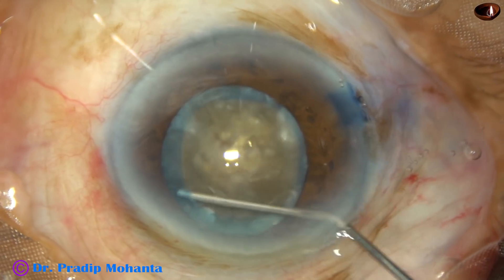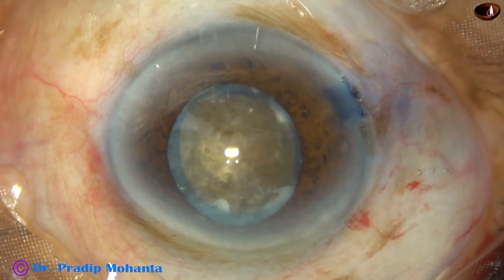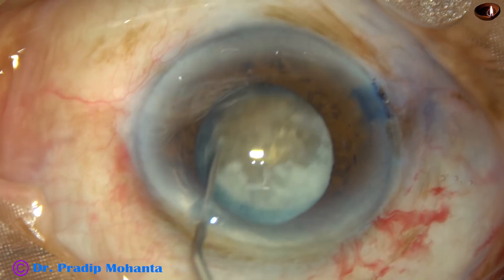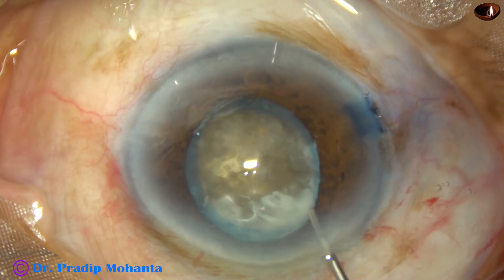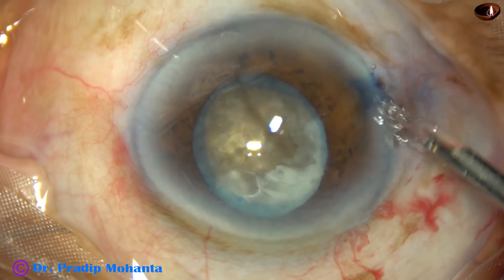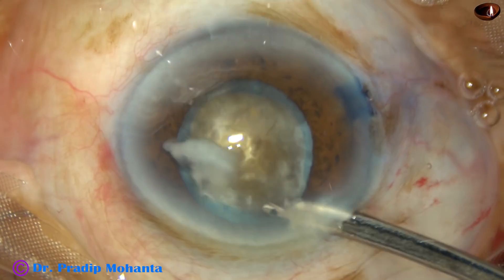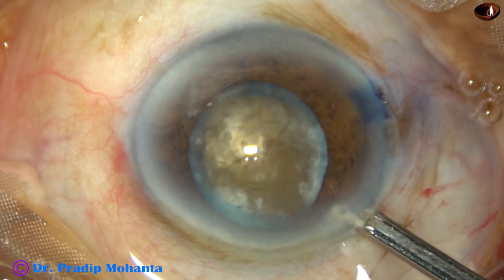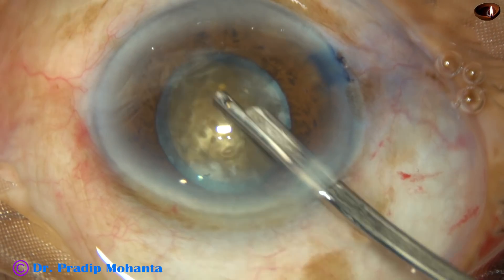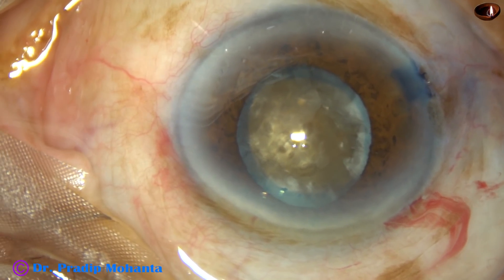I am doing hydrodissection again. Very small amounts of fluid are being injected at multiple points. The nucleus has rotated very nicely and I am very happy. As the nucleus has rotated, I can see some more white flaky material just in front of the main incision. So I am going to use the 23G Simcoe again to remove this white material. Without removing this, if I apply ultrasonic energy, this material will run helter-skelter and there can be endothelial cell loss because of these movements.